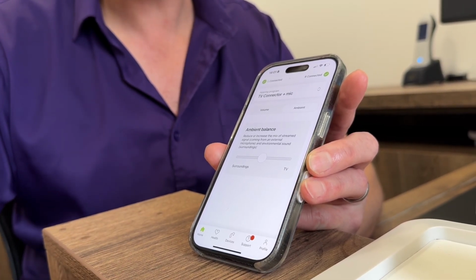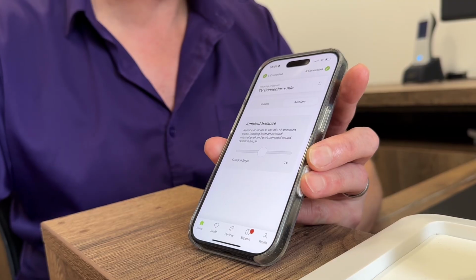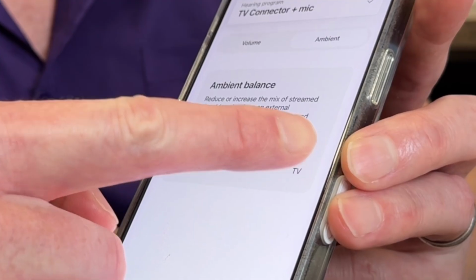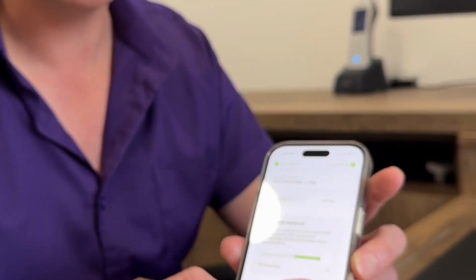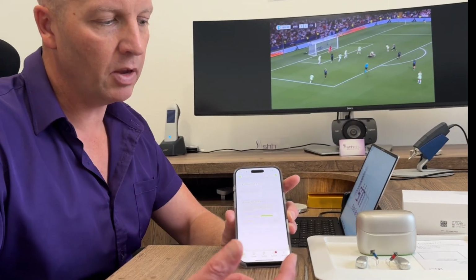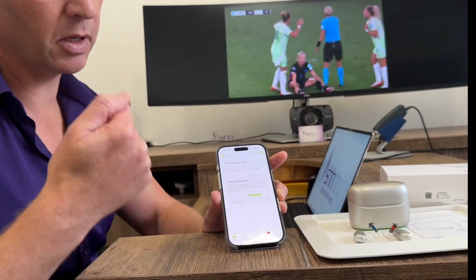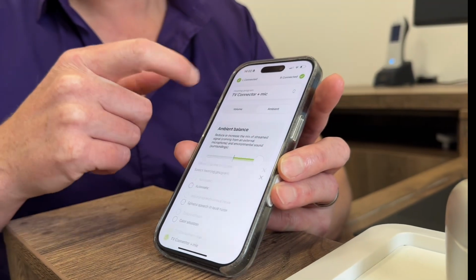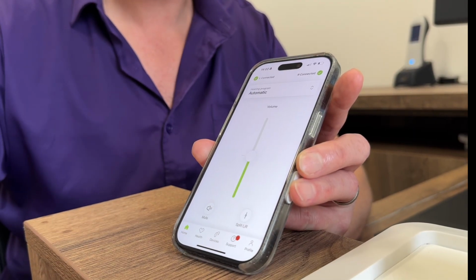However, if you didn't want to hear what was going on, for example, your other half's on the telephone, and you're really wanting to watch the football on the TV, then you would scroll ambient balance towards TV, either fully or you can decide how much you want to hear of the surrounding. Going all the way over to TV, you're just going to hear what's on the TV itself. Then if you don't want to watch the TV any further, it's as simple, you either turn the TV off and it will automatically turn back onto automatic, or if you click onto TV connector and click onto automatic, that will disconnect you from the TV.